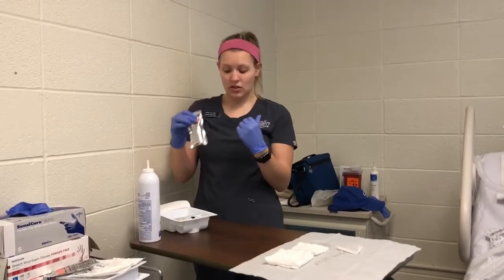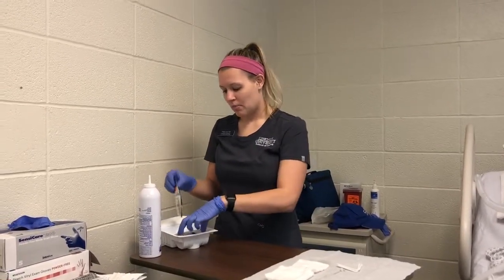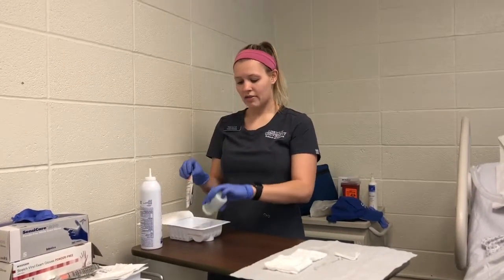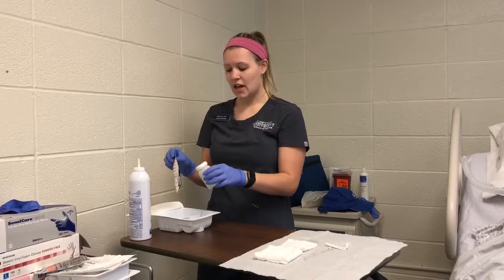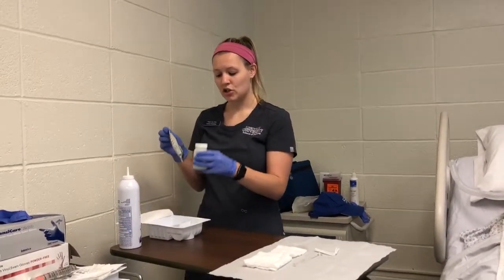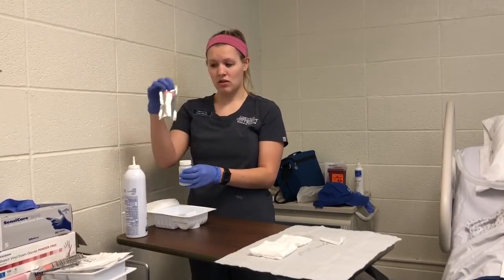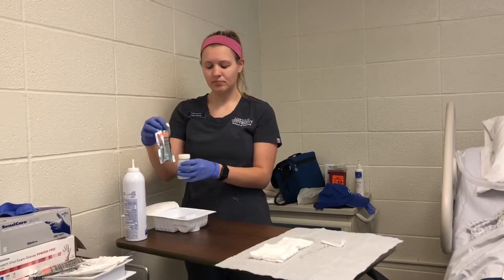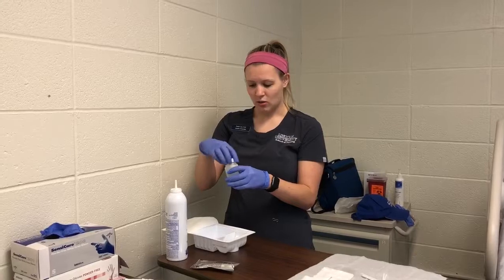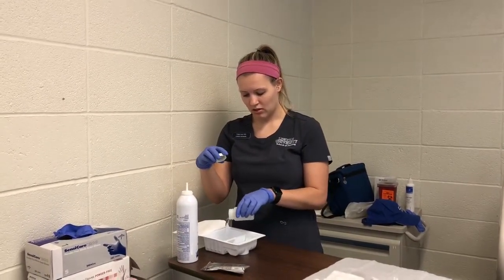For the mannequins, we can't use the peroxide, so I'm just going to use the sterile water that's in the kit. But what I would do is I would do sterile water in each side, and then I would add the peroxide to one of the sides. So I would have just sterile water in one side, and then I would have sterile water mixed with hydrogen peroxide in the other side. But for this, we're just going to use the sterile water since we can't use the peroxide on the mannequins.